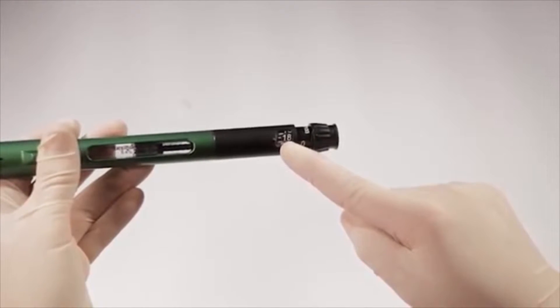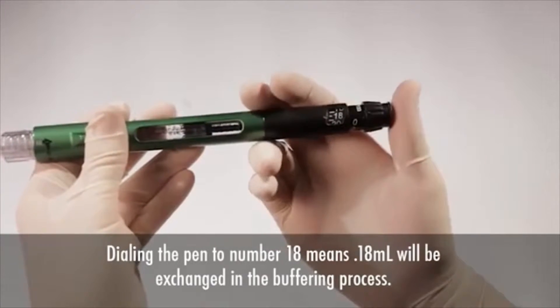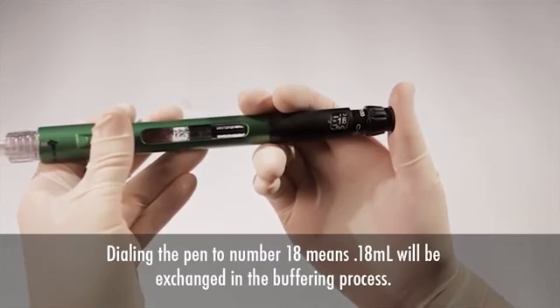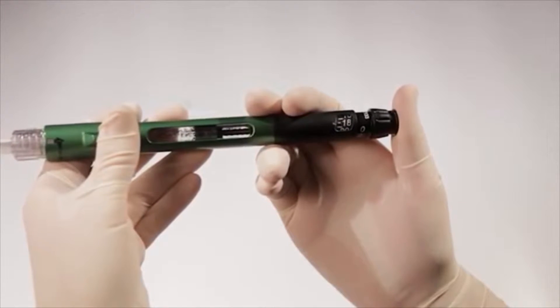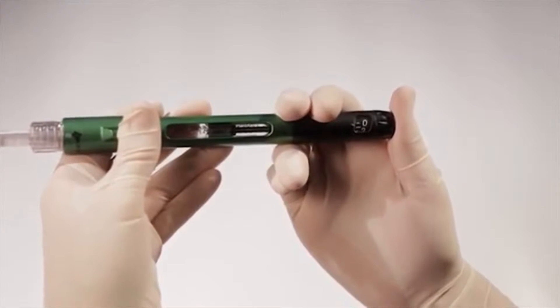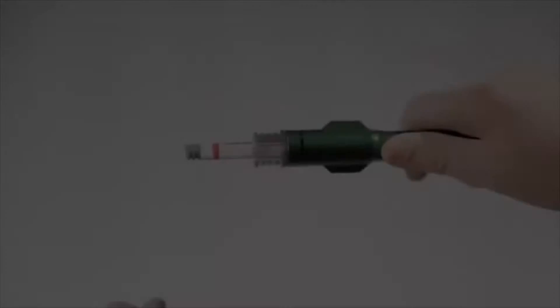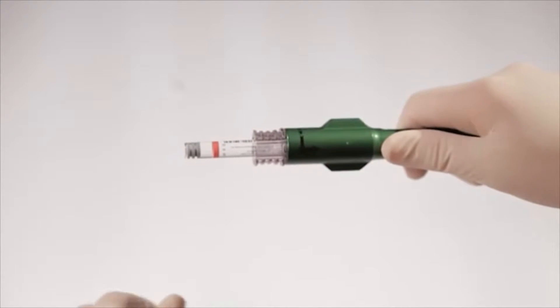For example, dialing the pen to the number 18 will dispense 0.18 ml from the 3-milliliter cartridge to the 1.8-milliliter cartridge. After dialing the desired amount of solution to be mixed, depress the dispensing button straight in to mix solutions.